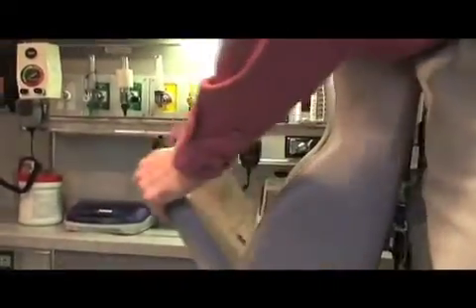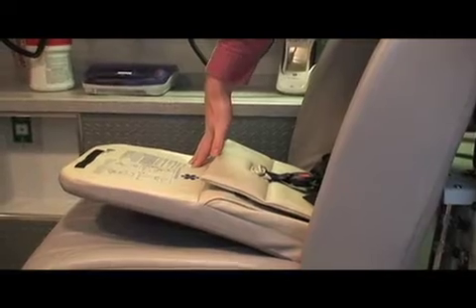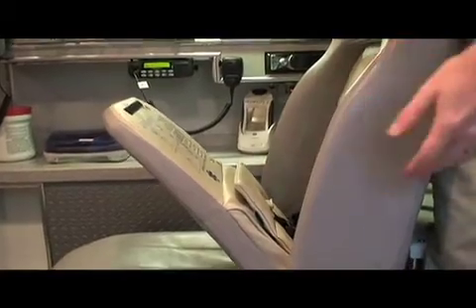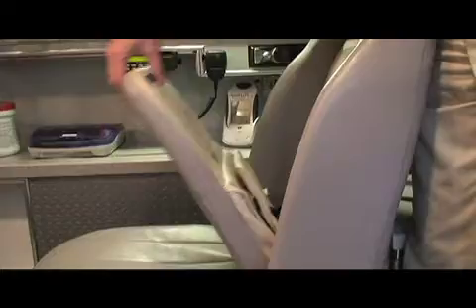The other thing on this truck is the captain's chair here, which has a built-in car seat. You can pull down on the captain's chair, and that provides you access to the car seat. So if for some reason you have a child that you don't want to ride on the stretcher, or does not necessitate that care, then you have the ability to transport them.